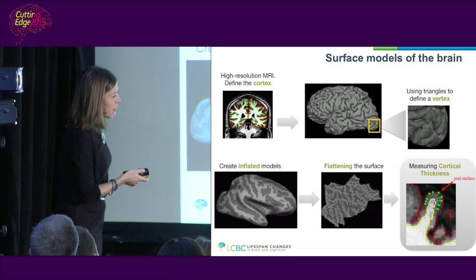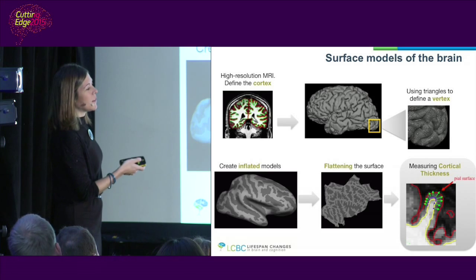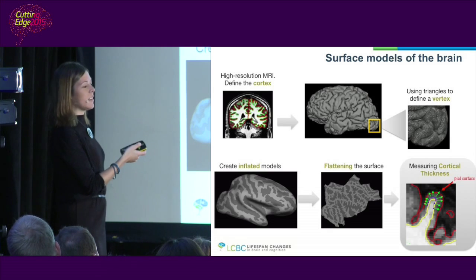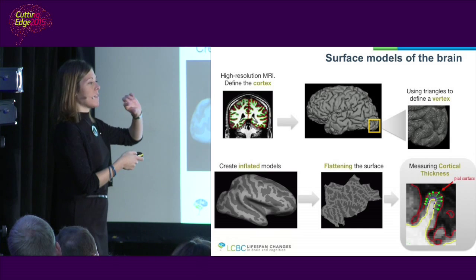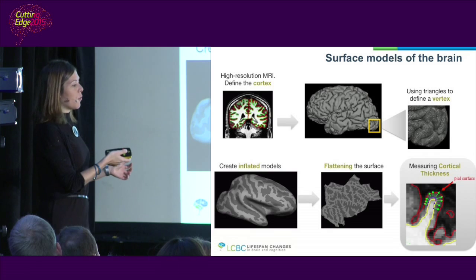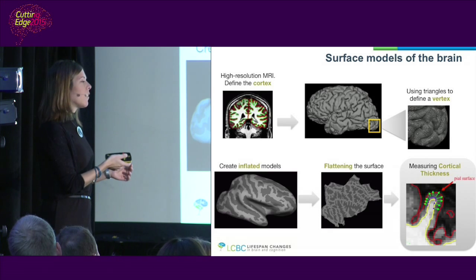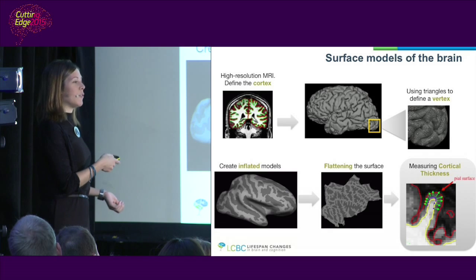I see that some of the arrows have been displaced here. That means that we can know how thick our cortex is, at each point of this curve. So we pretend to have even higher resolution than the one we had with the voxels.